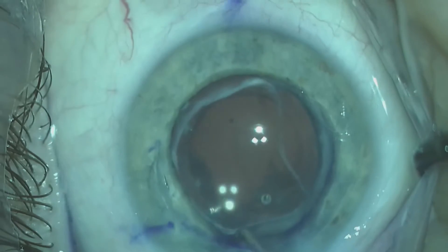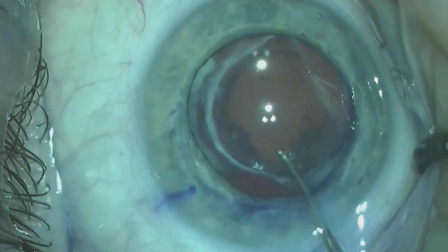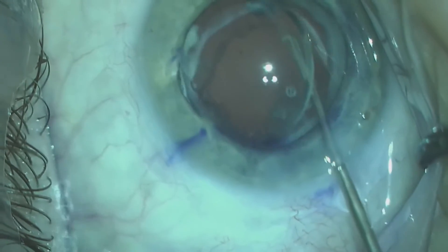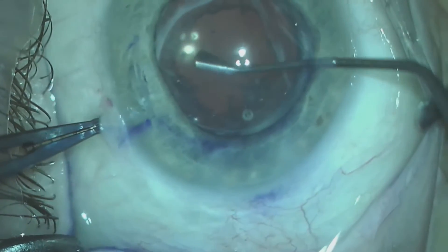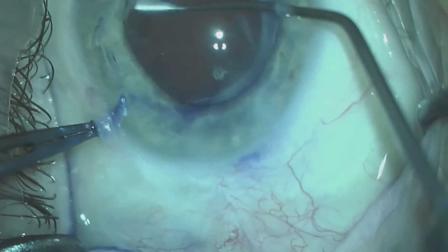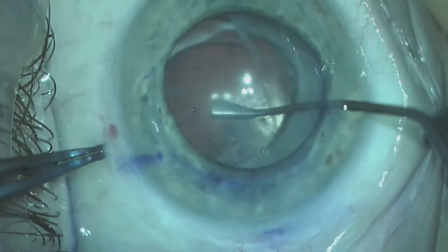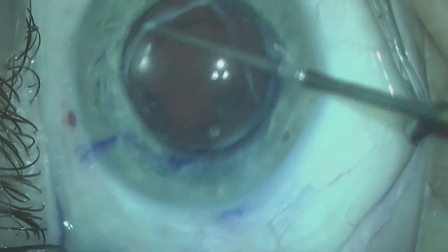At 3 o'clock, you will also see some of the anterior lens epithelial cells that have come free from the anterior capsule. We once again return to using a Sinski hook; I am able to go posteriorly. That did not free up the lens, so I decided to try and sweep some of the anterior lens epithelial cells with a Singer sweep. This was once again unsuccessful, and we decided to stop due to the zonular laxity.